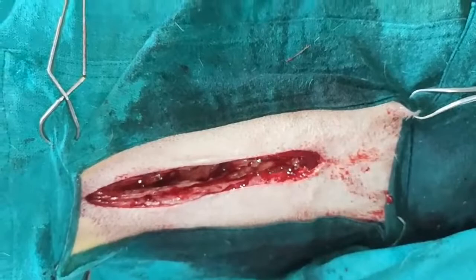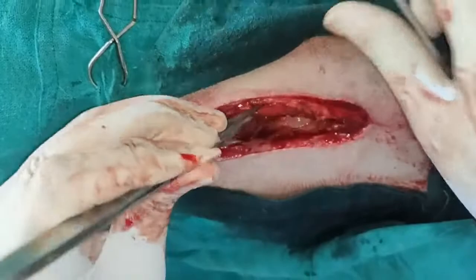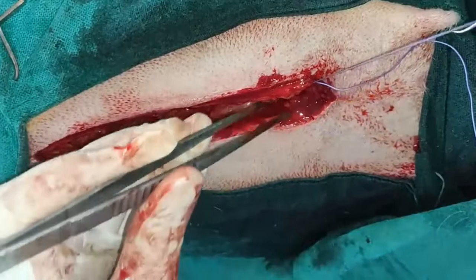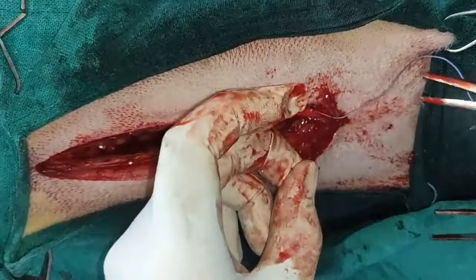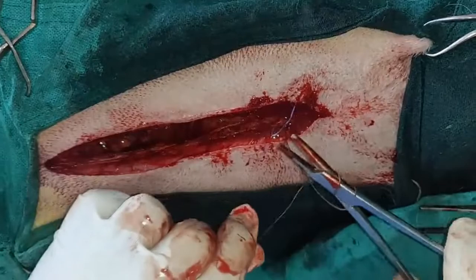So now the thing is closure of this laparotomy incision. This is a large breed dog. Normally in a small animal, I prefer number one polyglactin 910 in simple continuous. But since the animal is very big, 42 kg, and keeping in view that it was off feed for the last 14 days, its weight probably would have been 48 or 50. So for such an animal, I always prefer simple interrupted.